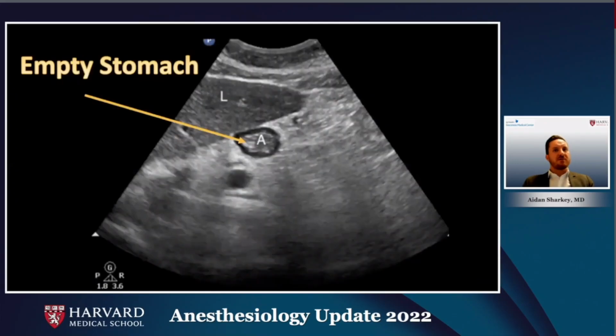When the stomach is empty, it appears small, flat, and collapsed in both the supine and lateral positions. The walls of the stomach can appear relatively thick, and when round or oval in shape, it has often been described as having a bullseye appearance. It may be possible to observe the multiple hyper and hypoechoic layers of the gastric antrum when empty. In particular, the muscularis mucosa may be prominent when the muscle is in a relaxed state, as seen in this image.